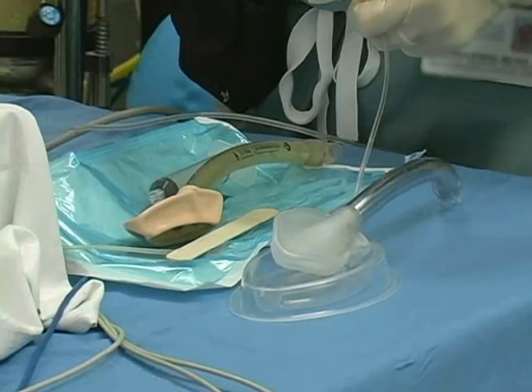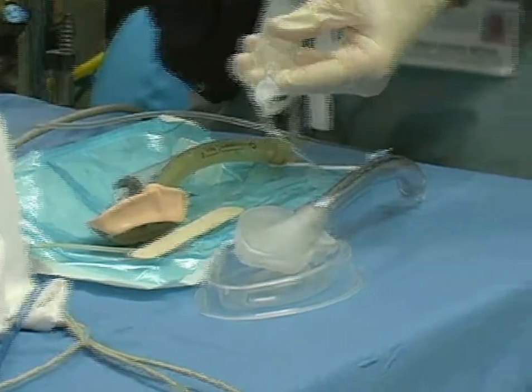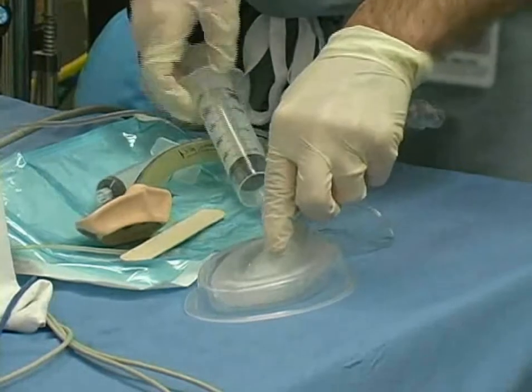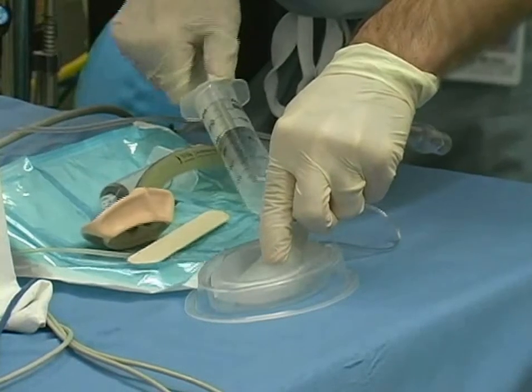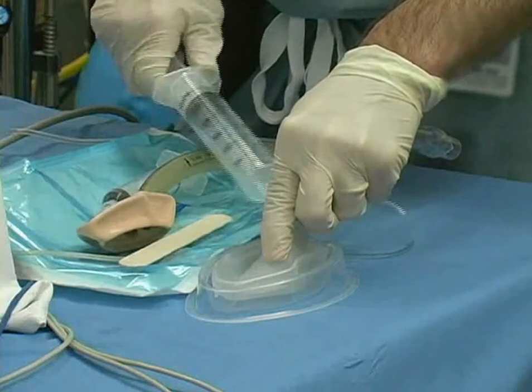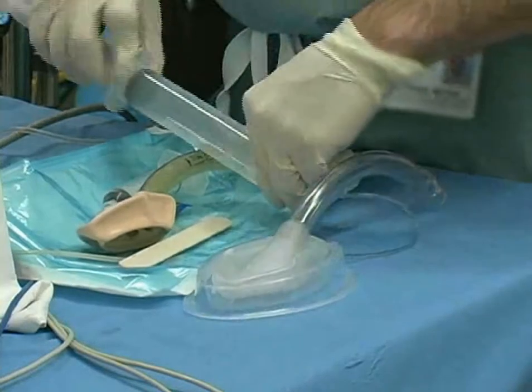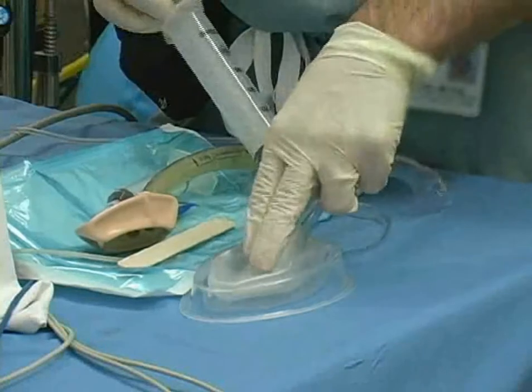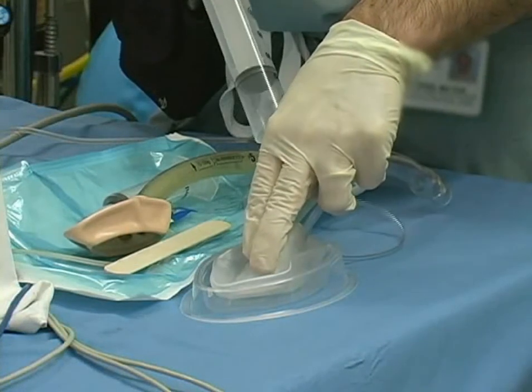To check the cuff, inflate with 50% more air than the maximum recommended volume. Examine for leaks or failure to inflate. Proceed to deflate the cuff completely by pressing the cuff against a clean, smooth surface while simultaneously aspirating the air with a clean syringe.